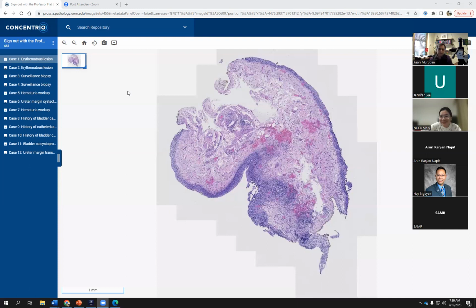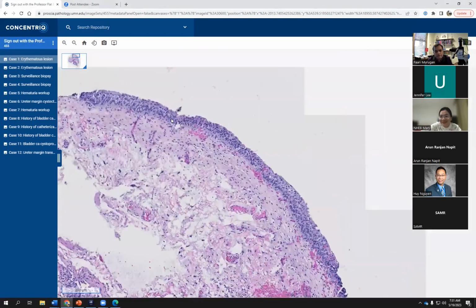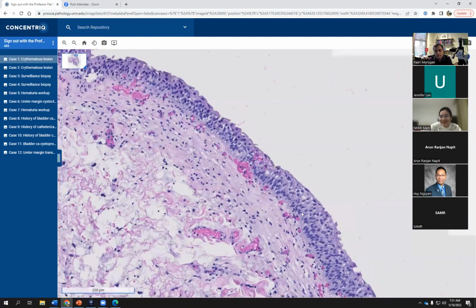In other patients, the urologist might describe a larger tumor that they can visualize, and then biopsies around the bladder adjacent to the tumor may show carcinoma in situ type lesions. So that is the other situation in which you might get a different clinical history. Okay, so this particular lesion, as you can see, does have normal-looking urothelium in these areas. And it is normal looking because the nuclei are nicely polarized. It is low grade in appearance. There are nice umbrella cells on top. The cells are not too large. I don't see any visible nucleolus, right?